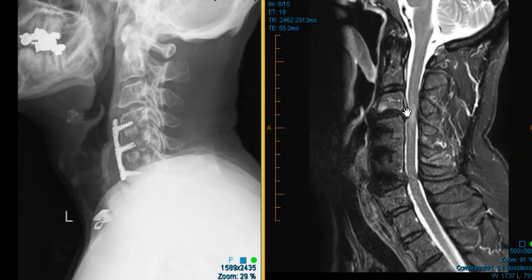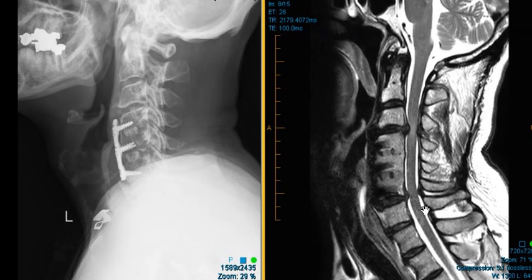This is that disc herniation. You also have another smaller disc bulge or protrusion down here lower at the bottom level. You can see how this fusion block creates abnormal mechanics of stress, even worse at these two levels. They develop new disc herniations and have to fuse these, and of course there's going to be abnormal stress on the levels adjacent to that. So this is a good example of one of the problems of a fusion like this.